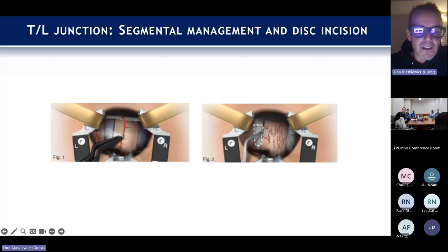So this is taking the segmental artery. Again, that's sort of objective number one once I get in there: identify where this is. I'll always have hemoclips handy too, because sometimes when you cauterize a vessel of significant diameter, even though you cauterize it, the lumen remains open. And so I'll just snap a clip on here if I need to.